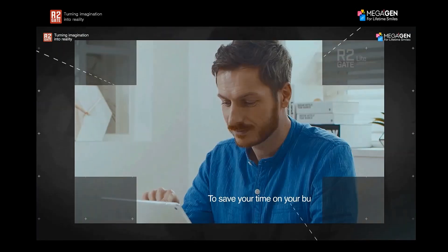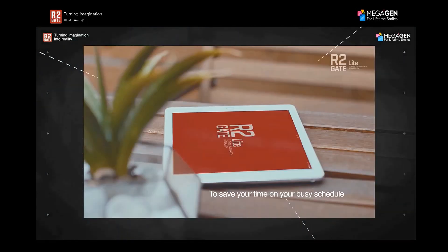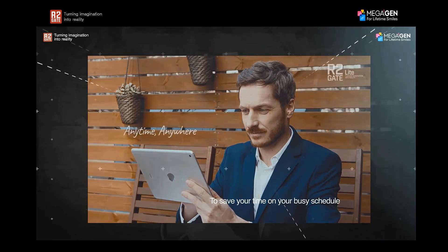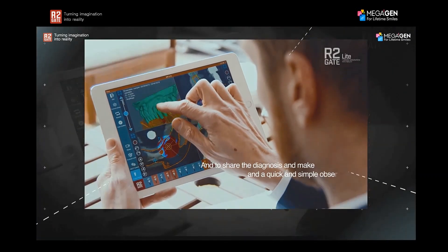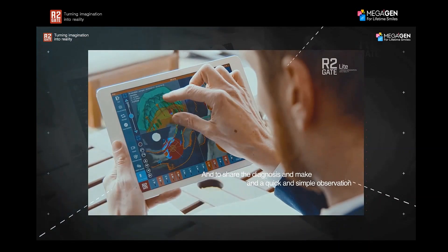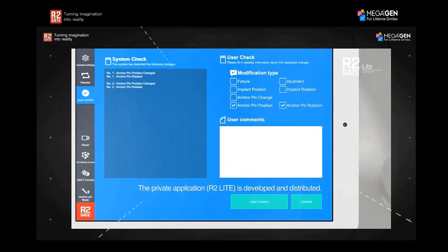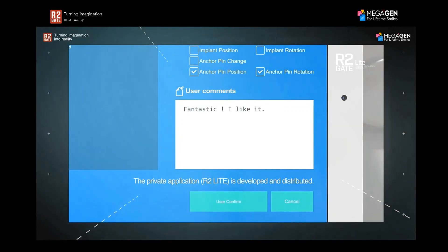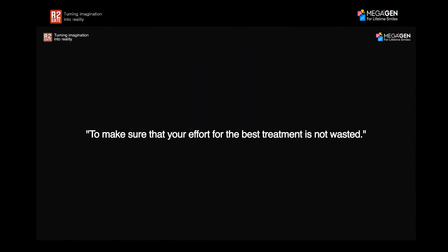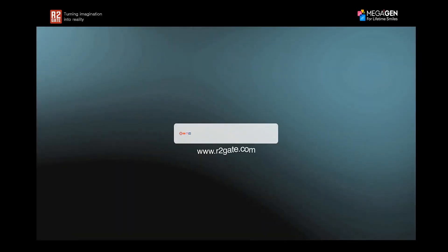Whether it was doing a cephalometric analysis, assessing the skeletal relationship of the patient, opening the vertical, establishing a new occlusal plane, doing a smile design, doing implant planning — really everything you can now do with the software. But today I'll focus on using R2Gate as a treatment planning software for implants mainly.